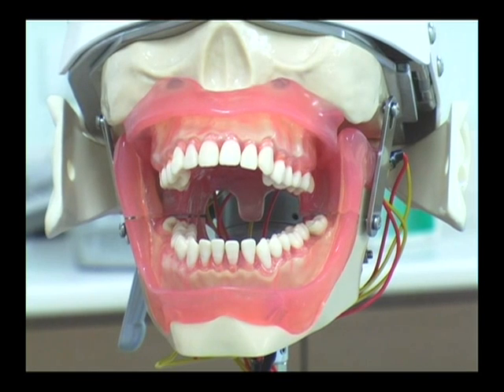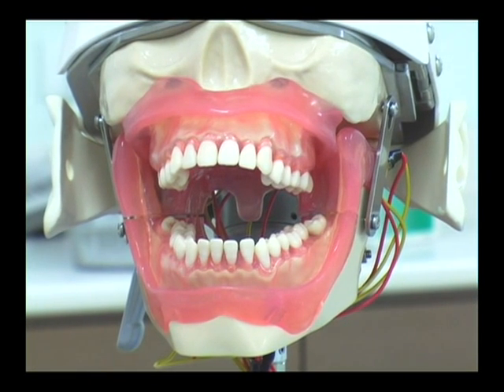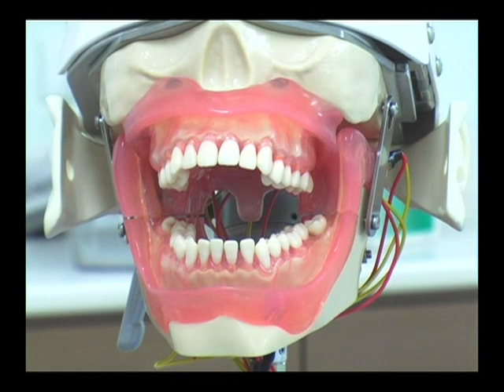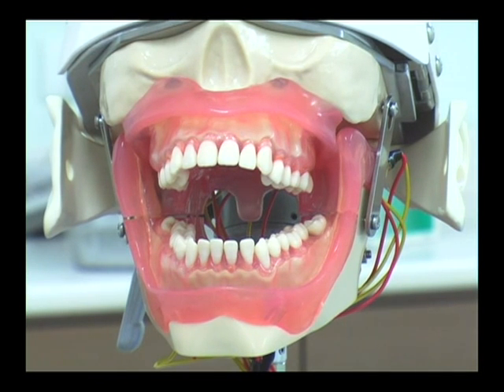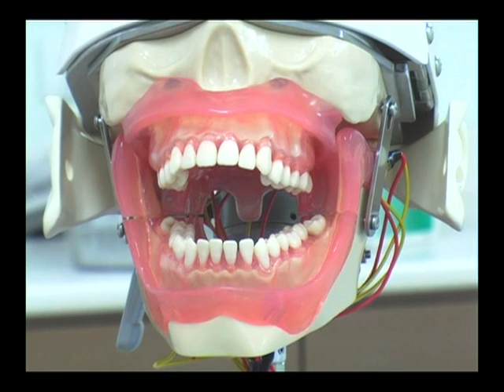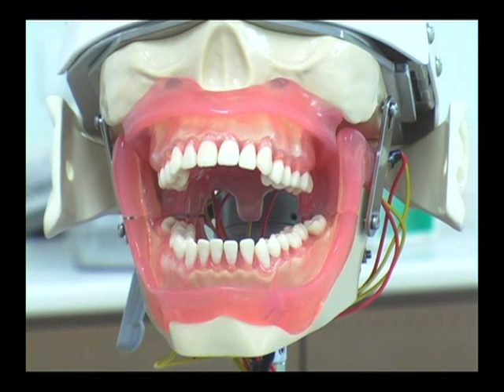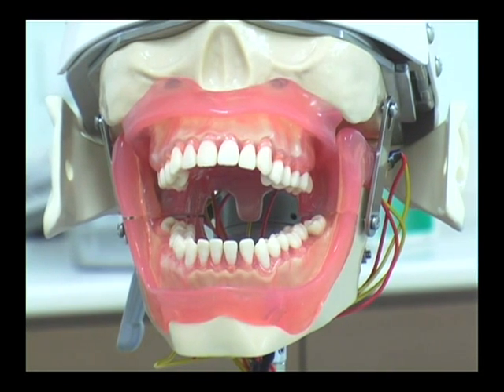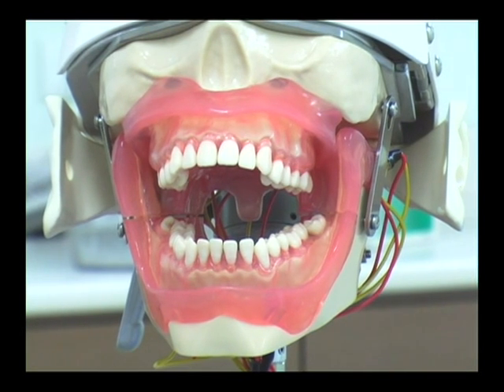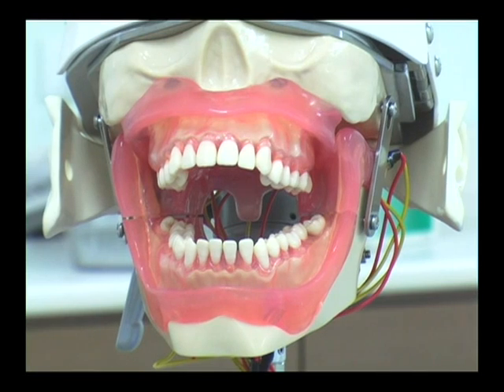Video demonstration for administration of inferior alveolar nerve block on a mannequin. It is very important for the success of the local anesthesia that you should be aware of the anatomy. We are going to switch on to the other model quickly to see what are the important landmarks which we should recognize and identify while administering local anesthesia.